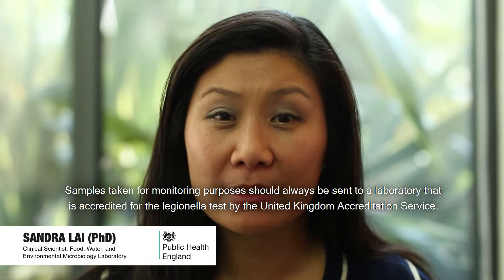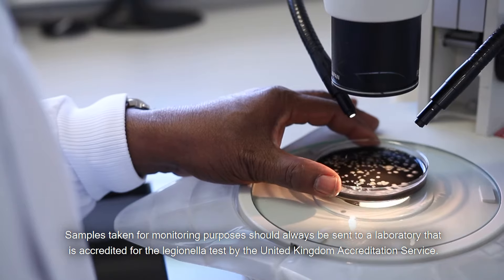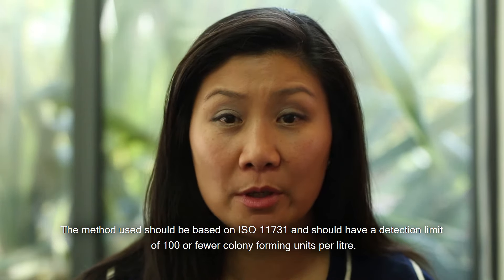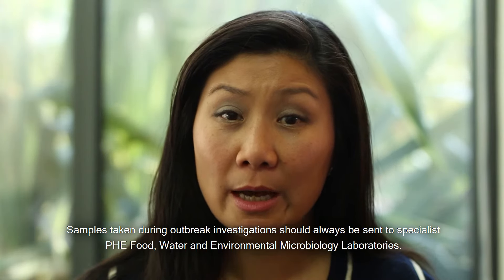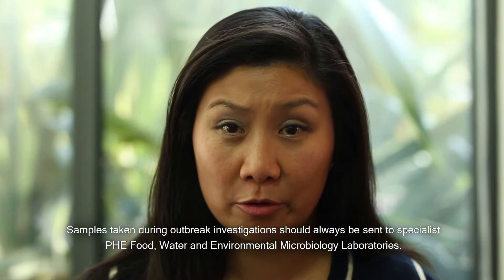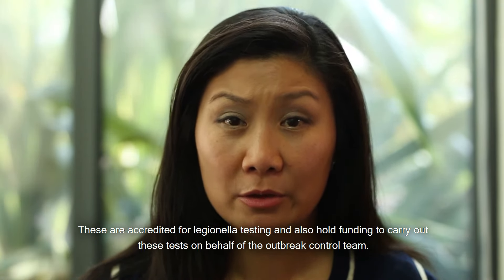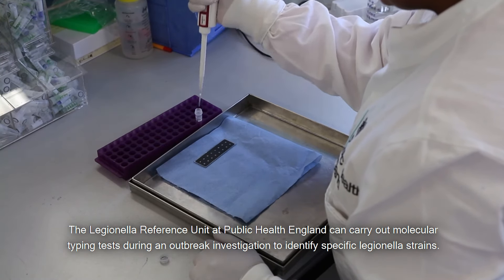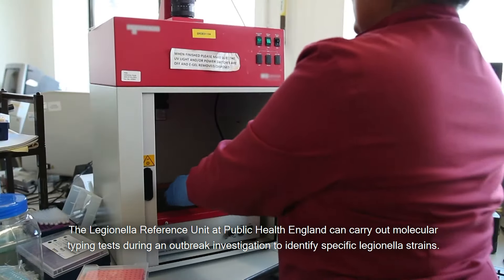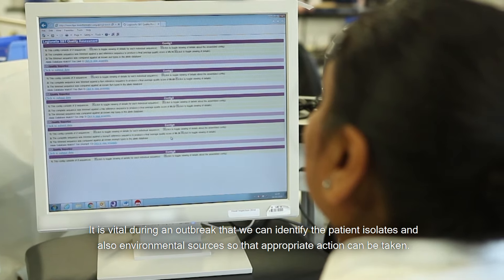Samples taken for monitoring purposes should always be sent to a laboratory accredited for Legionella tests by the United Kingdom Accreditation Service. The method used should be based on ISO 11731 and should have a detection limit of 100 or fewer colony forming units per litre. Samples taken during outbreak investigations should always be sent to specialist Public Health England food, water and environmental microbiology laboratories. These are accredited for Legionella testing and also hold funding to carry out these tests on behalf of the outbreak control team. The Legionella Reference Unit at Public Health England can carry out molecular typing tests during an outbreak investigation to identify specific Legionella strains. It is vital during an outbreak that we can identify the patient isolates and also environmental sources so that appropriate action can be taken.